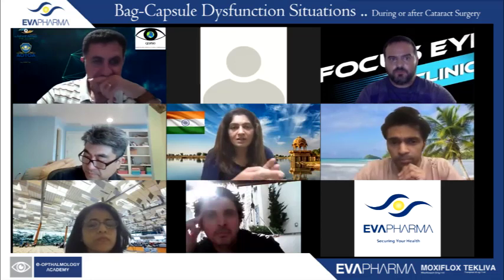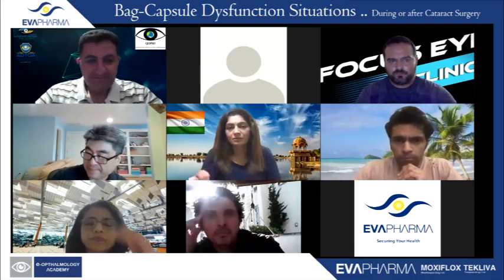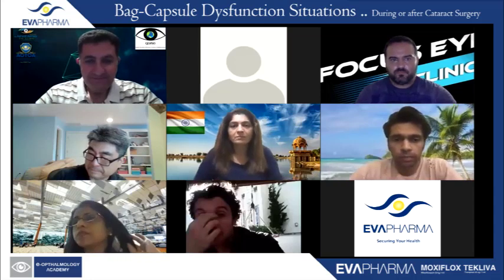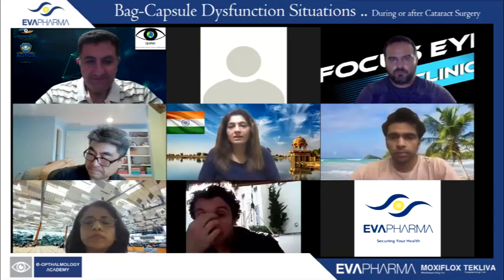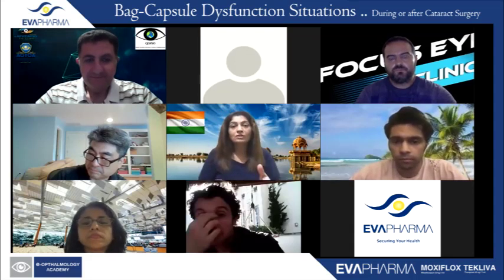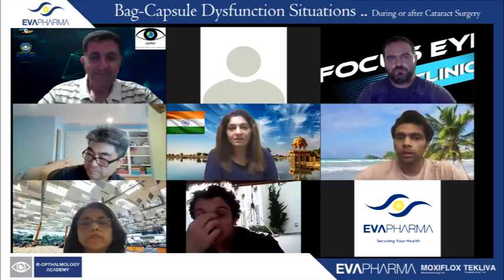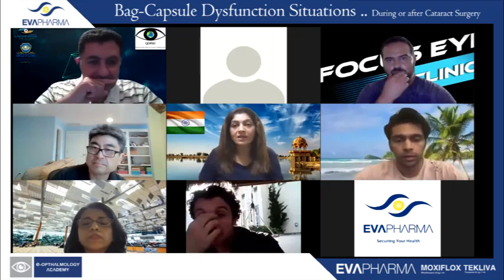This is just a discussion that in case you have to do this, whether you can do that or you cannot do that. But yes, what you are saying is also there. We have to take many things into consideration and then go ahead regarding the decision that, okay, this is what is to be done. It also depends how much refractive error or anything of that kind you're having, and how much you can correct on the corneal surface and how much you cannot.